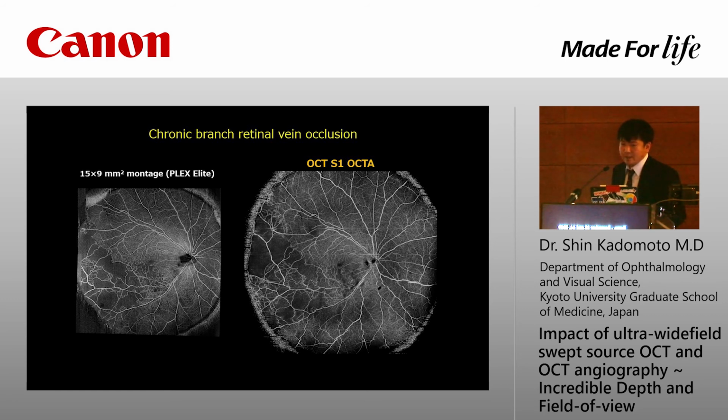This is a case of chronic BRVO. Ultra-widefield OCTA is very good at visualizing the peripheral non-perfusion areas. However, as I mentioned, the drawback of ultra-widefield OCTA is that it is not good at visualizing small macular non-perfusions.